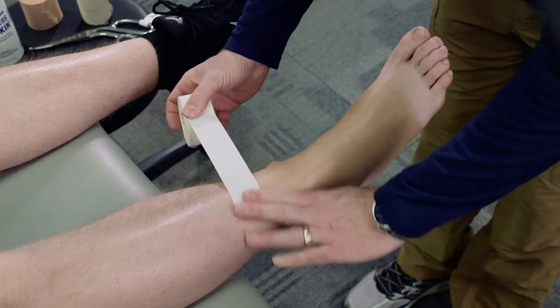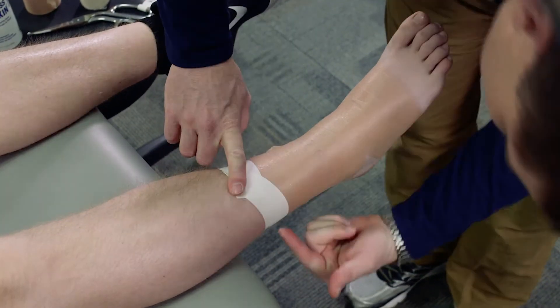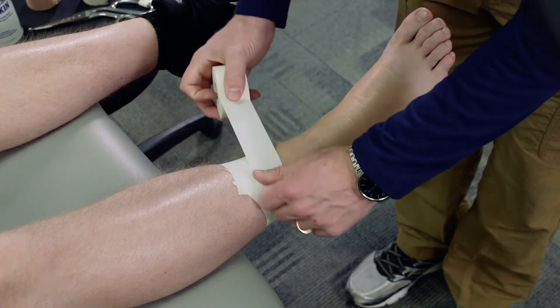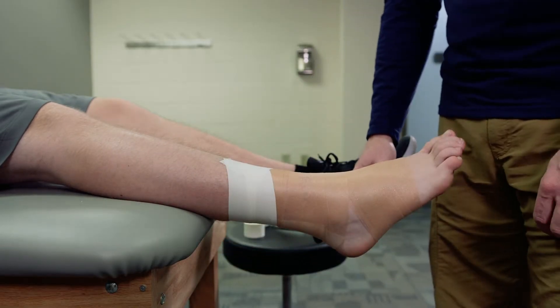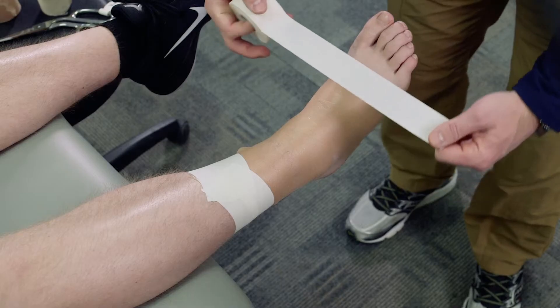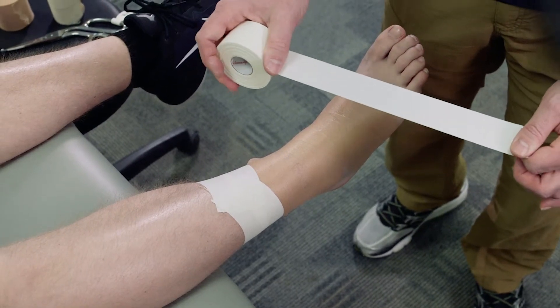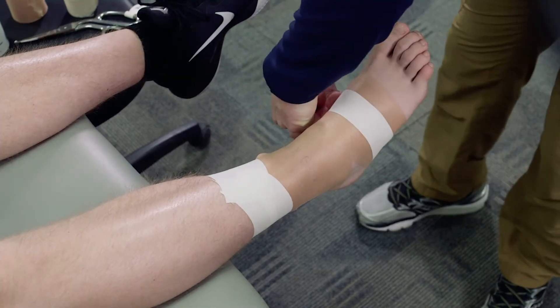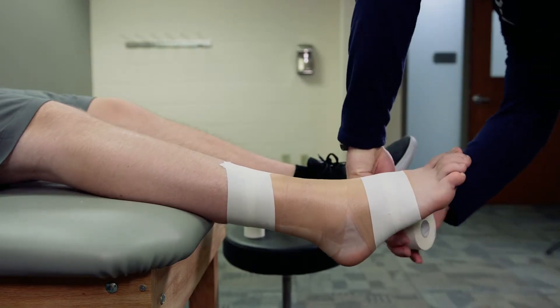I'm going to place my first anchor directly on the skin over the pre-wrap. I'll angle it so it lays flat, since the calf is not a perfect cylinder. I'll do a second piece overlapping by about half just below, giving a nice wide band for the anchor. Then I'll do two anchors down at the base of the foot, coming from the top and angling back down towards the heel, giving a nice wide base.